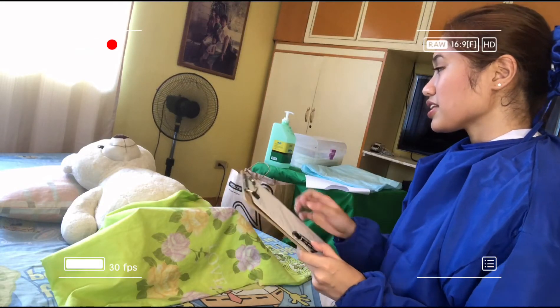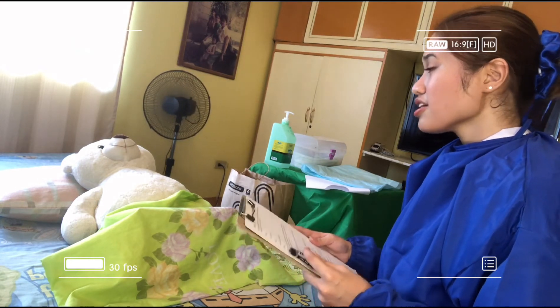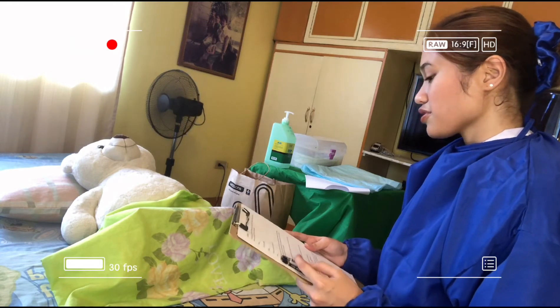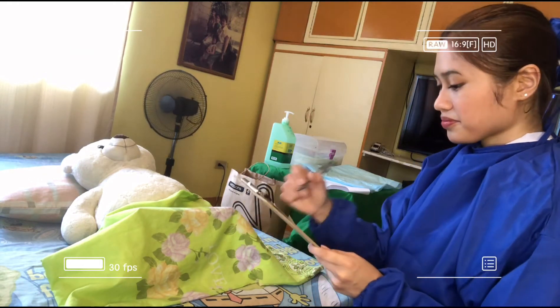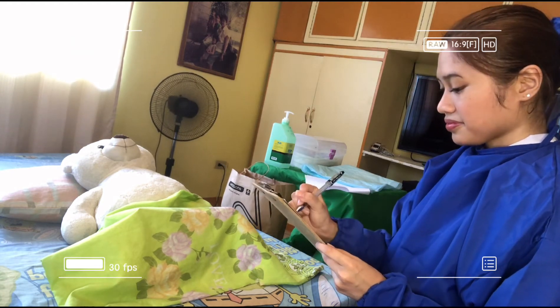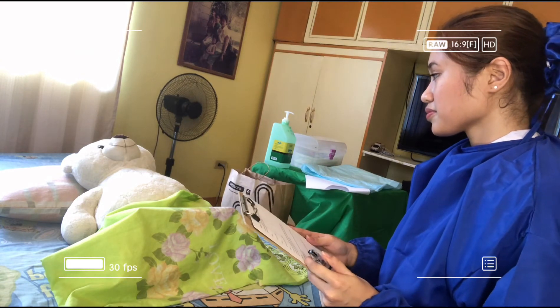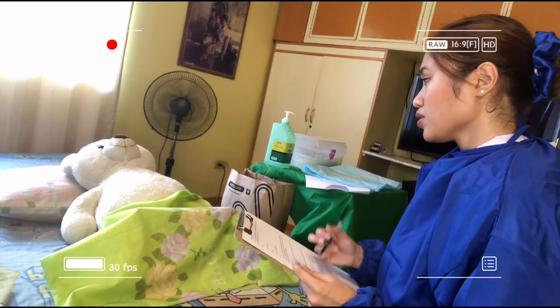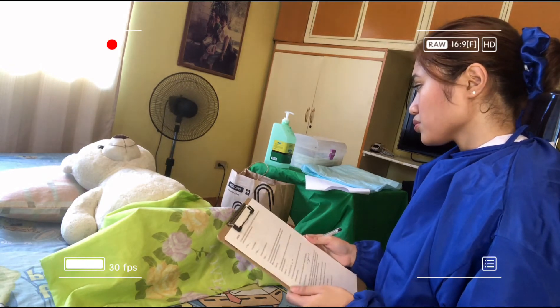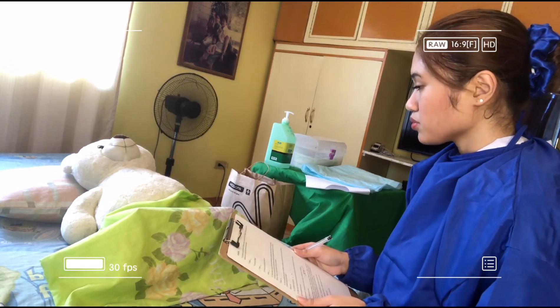Good day! I am Julian Diniz Gregorio from LBC High University of Science and Technology, College of Nursing, and I will be your student nurse for today. May I know your name? Christine Andrea Lopez. And your birthday? December 4, 2000. How do you want me to call you? Ms. Lopez will be fine. Okay, for today I will insert a Foley catheter. The Foley catheter is inserted into the urethra, the tube that carries urine out of the body.